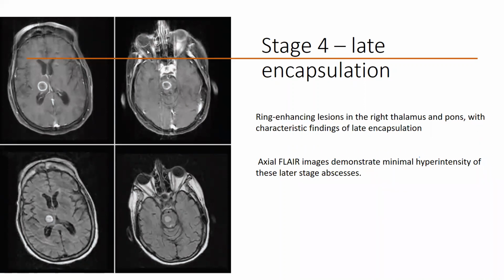Somebody says multiple small abscesses go in favor of pyogenic abscess. Reverse, no? Multiple lesions, multiple abscesses will be favoring TB. Pyogenic will be usually single. Correct, no, Dr. Shailesh? Probably. Sometimes difficult, but daughter cyst and conglomeration are more in favor of TB.